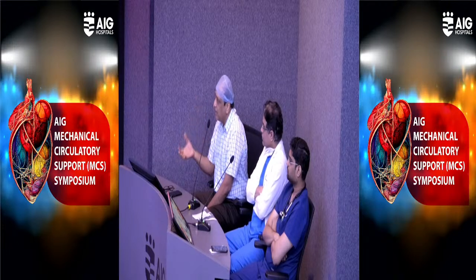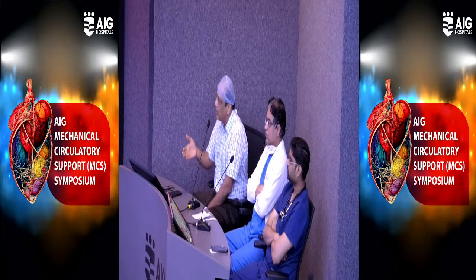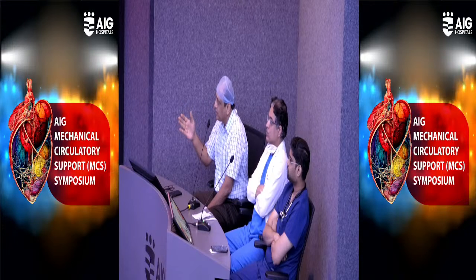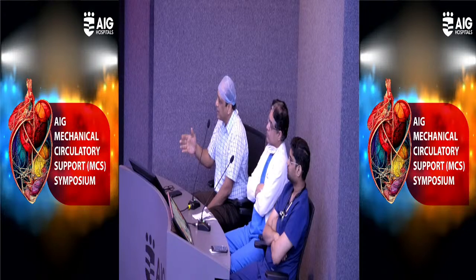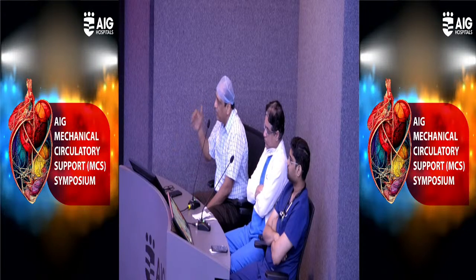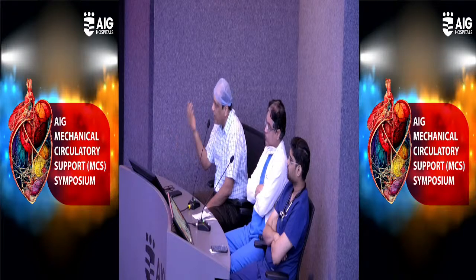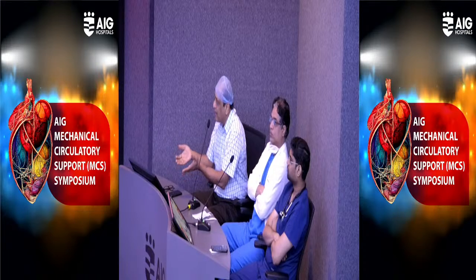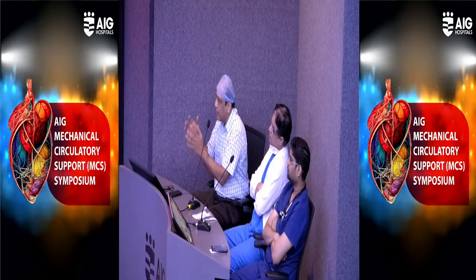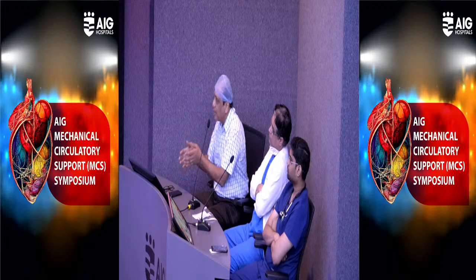See, actually the left ventricle gets blood from the left atrium, and the left atrium, when you're on ECMO, gets blood from the non-coronary collaterals, which are the bronchial collaterals. That is deoxygenated blood, and that is the cause of North-South syndrome. From the femoral artery you're pumping in, the heart is also getting some amount of blood, though we have completely emptied it. Where is it coming from? It is coming from the non-coronary collaterals, the bronchial collaterals in the lungs. And that is deoxygenated. That's why when you put a peripheral ECMO, you have deoxygenated blood going to the coronaries and to the brain.